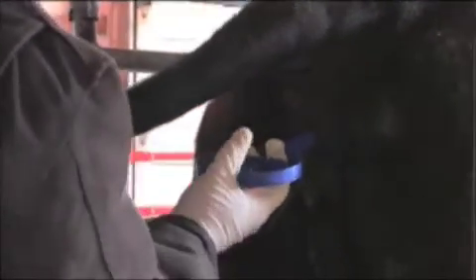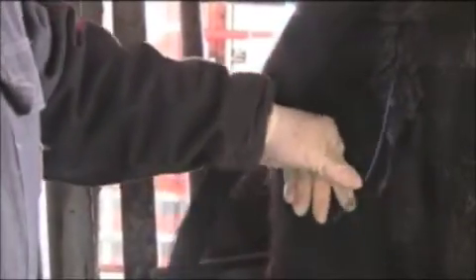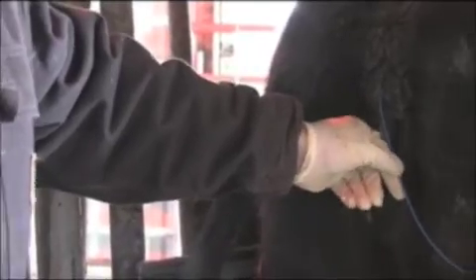Insert the applicator until resistance is felt. Depress the applicator trigger and slowly pull the applicator back out. Again, ensure that the tail of the CIDR is facing down to minimize the chances of the CIDR being pulled out during the estrus synchronization protocol.